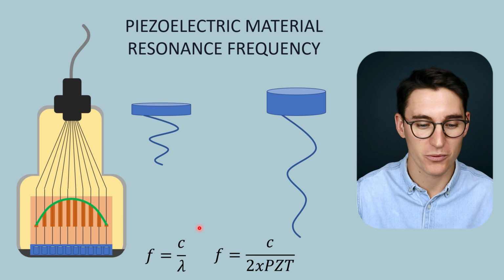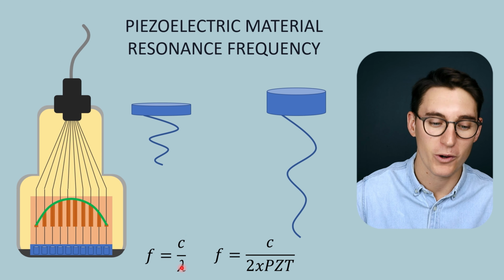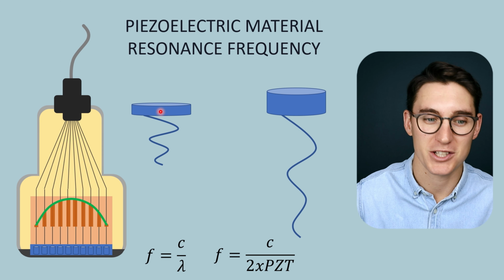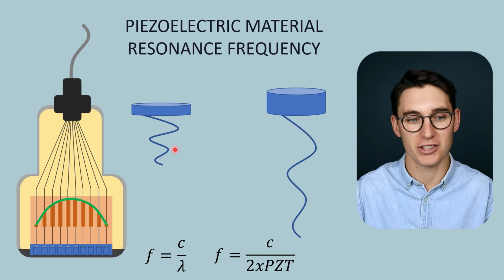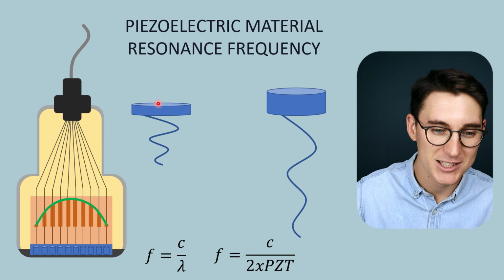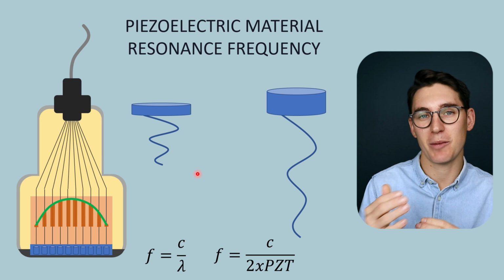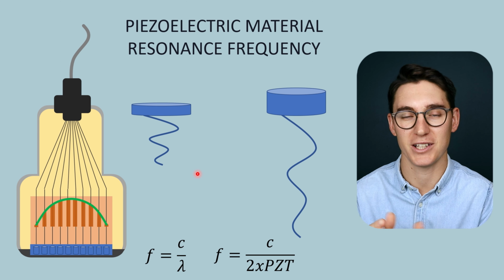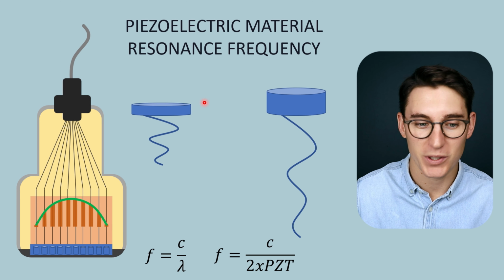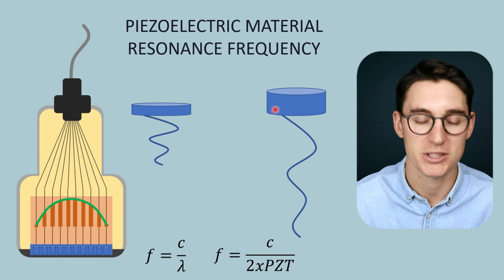So we've seen these formulas before. I've just rearranged it to put frequency equal to the speed of sound over a wavelength. We're trying to calculate the frequency of sound that this specific piezoelectric material will be creating. Now I mentioned frequency is dependent on the thickness of the piezoelectric material and the speed at which sound travels through that material. Now we've seen that the speed of sound within a material is constant for that material. It's dependent on the bulk modulus and the density of that material. So we can see that the speed of sound between these two thicknesses will remain the same, and that is a value that is specific to the PZT material.